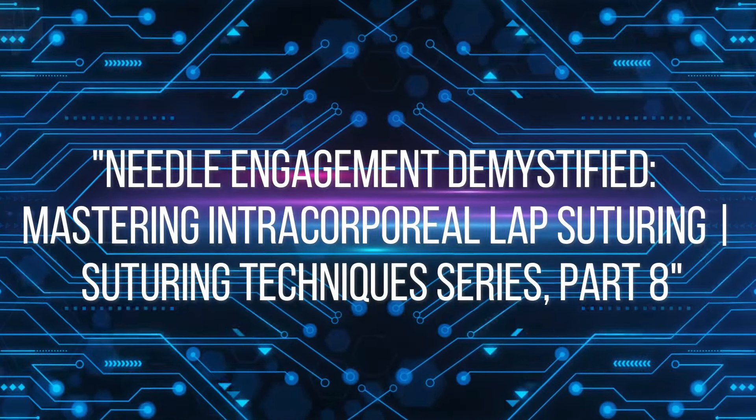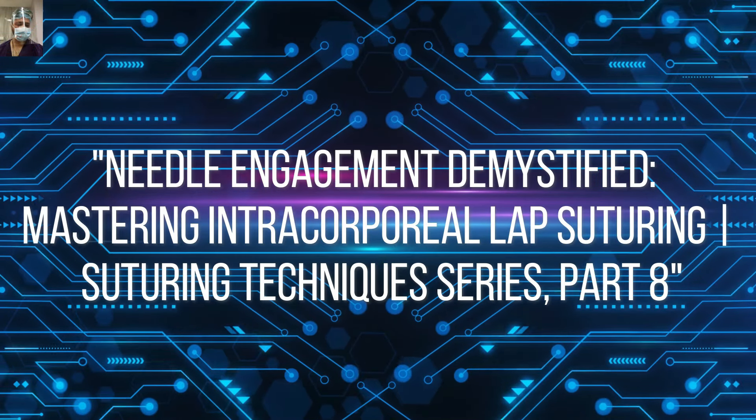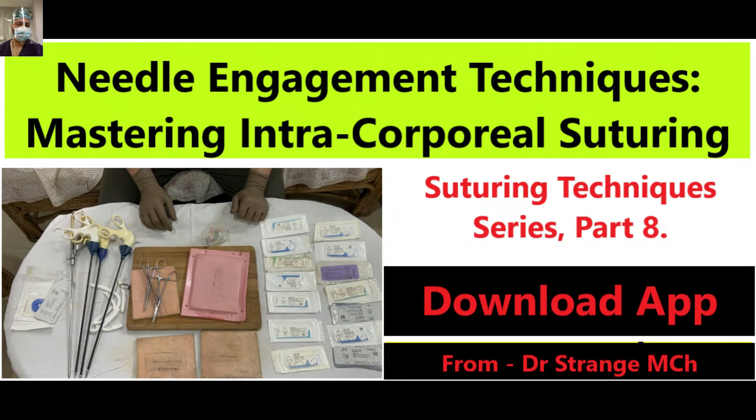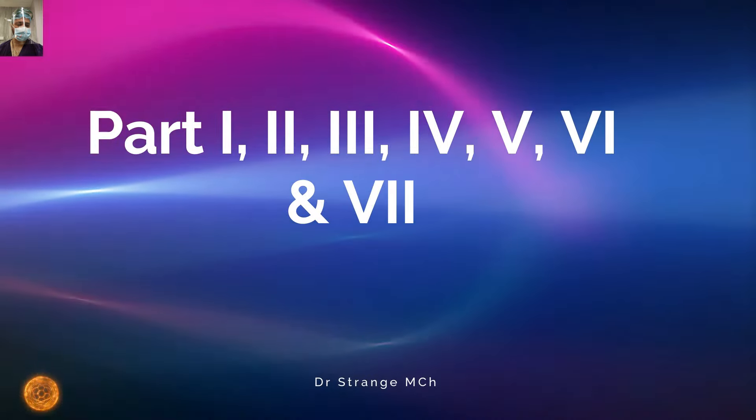Hello, future surgical masters. Welcome to a pivotal chapter in our journey through the realm of suturing techniques. In part 8 of our series, we are unraveling a mastery that lies at the core of intracorporeal lap suturing — how to flawlessly engage the needle in the needle holder. We will also showcase how much suture length is required during intracorporeal suturing and how to engage the needle and pass it across the ports.